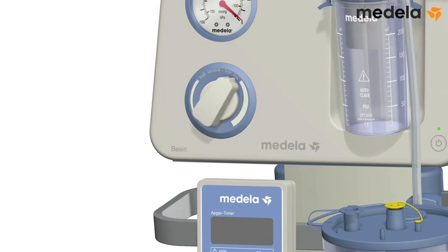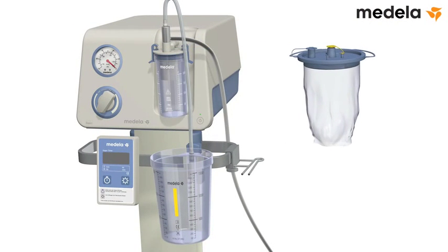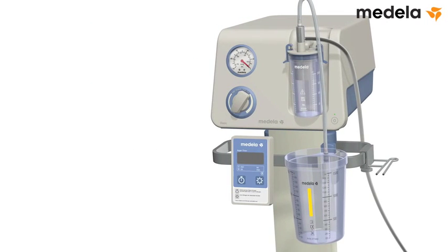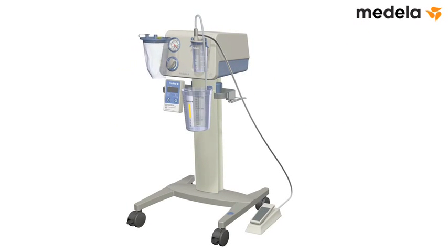Turn the vacuum regulator fully counterclockwise to set the vacuum level to zero. Remove the disposable liner and discard it according to hospital policy. To save setup time for the next procedure, insert a new disposable liner into the clean jar.